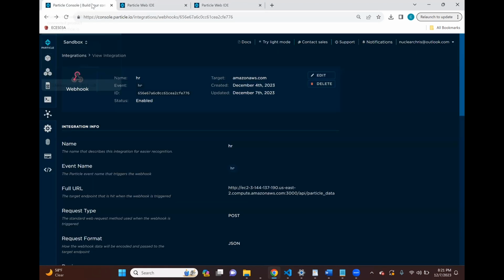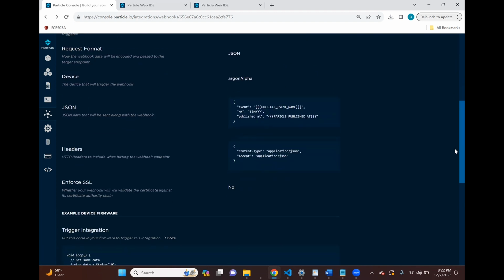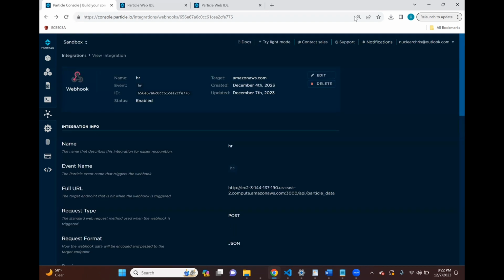Then the last section of this was setting up the webhook. And here we have the name of the webhook and the event name that triggers the webhook, which is HR, that's our heart rate. We are sending to our server with the API particle data. It's a POST type request in JSON format, and this is our device name. This is the custom JSON form that's sent to the server. And that's it for the Particle hardware code.